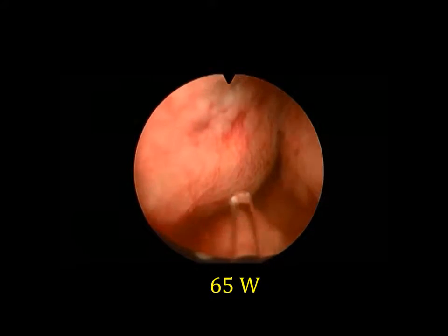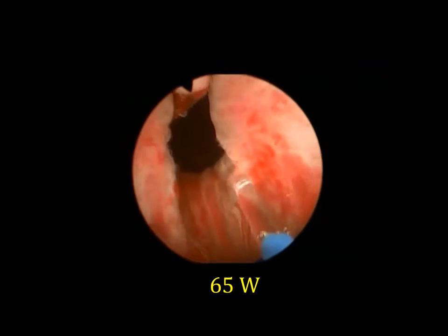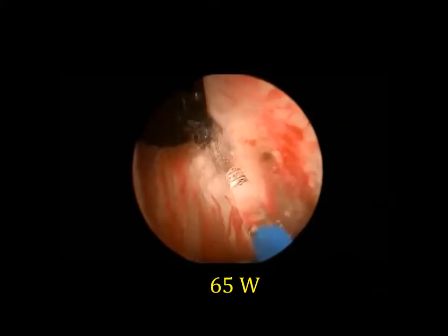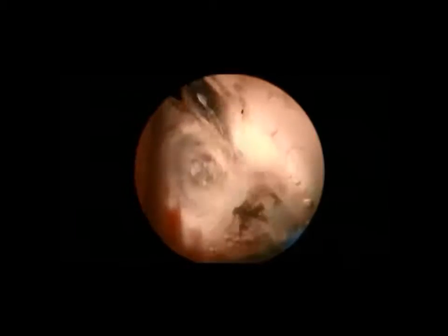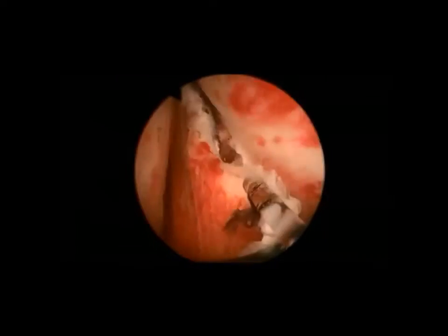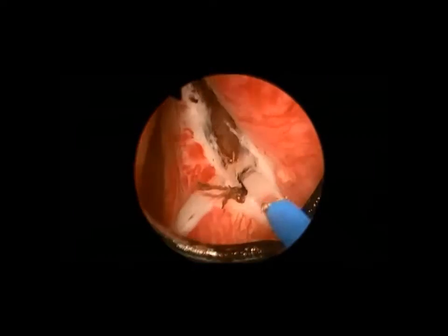Here we are making that 5 o'clock incision after inspection. We want to make a partial depth incision to increase irrigant flow, but we make no attempt to reach the capsule so as to avoid any chance of perforation of the capsule early in the case.